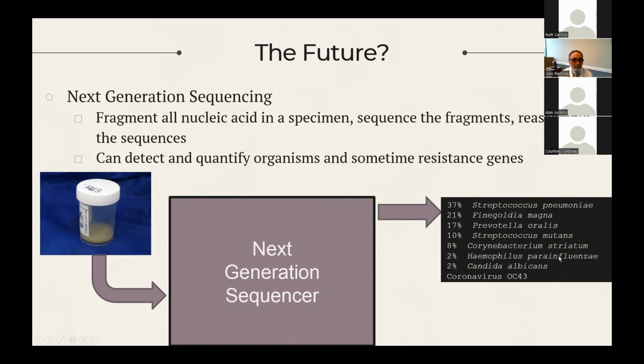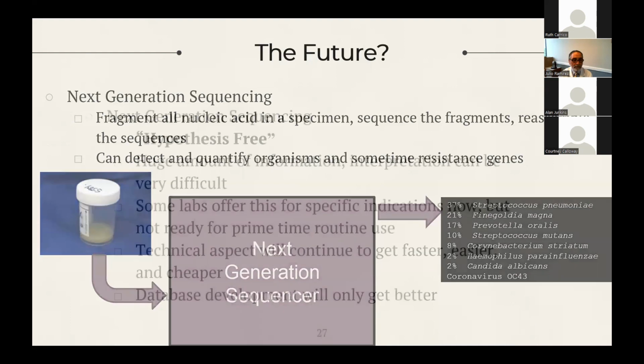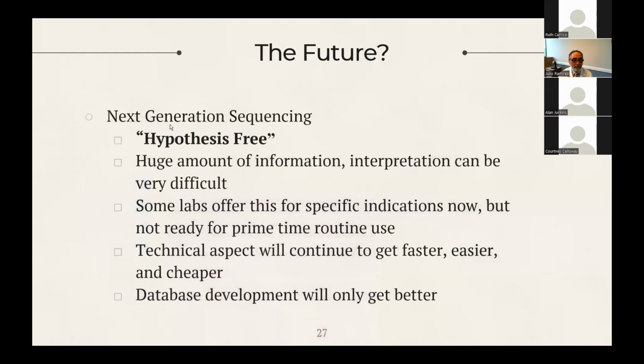It's going to detect all these different organisms. It's going to detect the relative concentrations of them. And we may get to a point where we just don't have to culture anymore. Great thing about it is that it's hypothesis free.